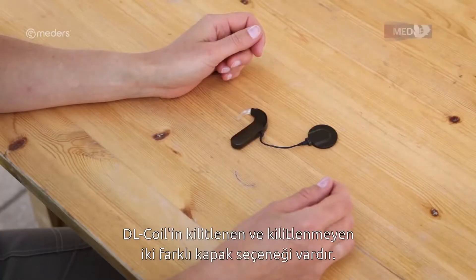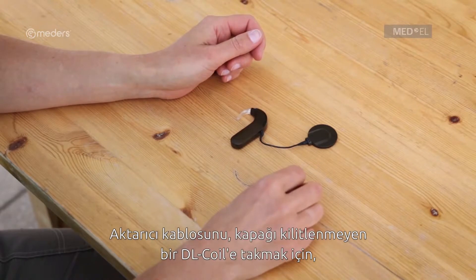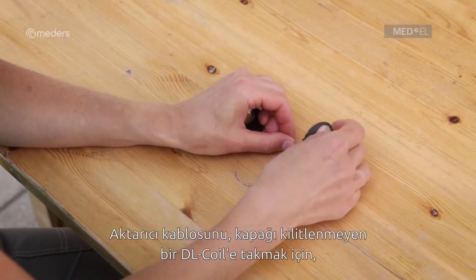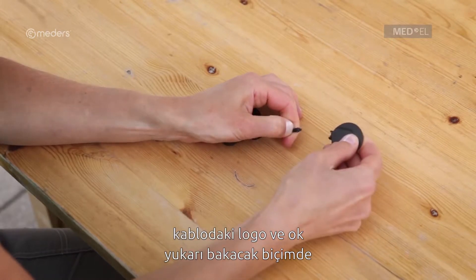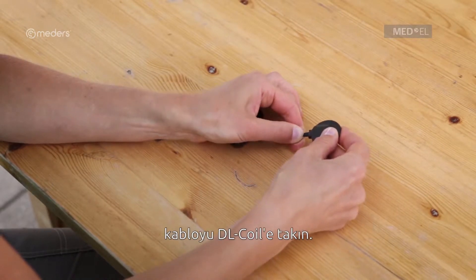The DL coil is available with locking and non-locking covers. To attach the coil cable to a DL coil with a non-locking cover, plug the coil cable into the DL coil with the logo and arrow on the coil cable plug facing up.